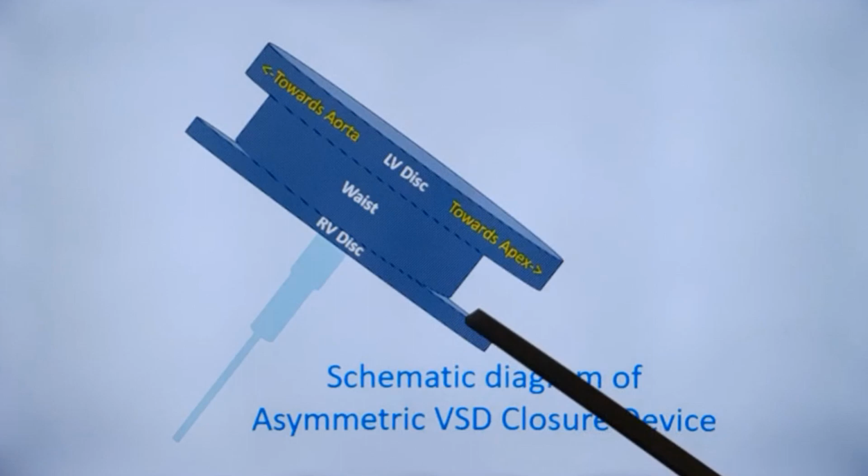material of the device. Other potential complications include device migration, pericardial effusion, embolic episodes, delayed onset of conduction disturbance, or even infective endocarditis. Fortunately, these complications are rare. As with other intracardiac device closures, subjects are started on aspirin to prevent thrombus formation on the device, which is continued for 6 months, which is the period required for endothelialization of the device surface.